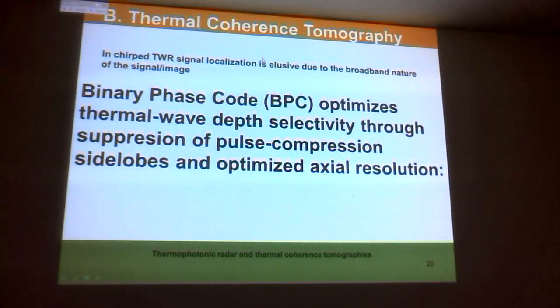What I have done so far, remember, even though we're doing this, we're still looking at a certain range of the peak, and that peak is relatively broad because it's a thermal wave. So the half width is quite broad. That means the actual resolution is not very good. You saw something, it's impressive, a dentist can use it, but if you really want to get to the three-dimensional effect, then you're going to have a problem.